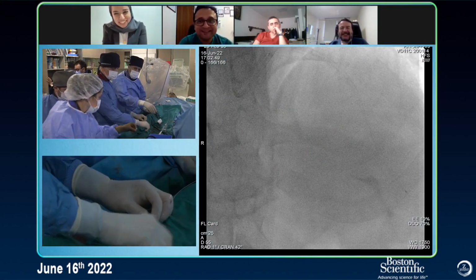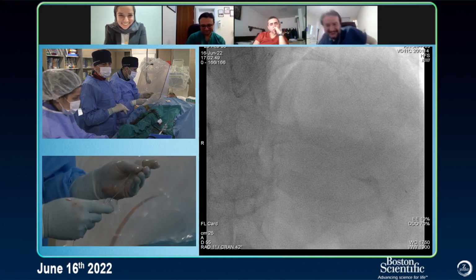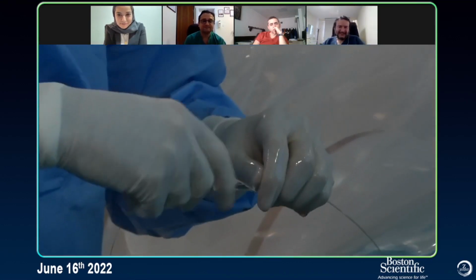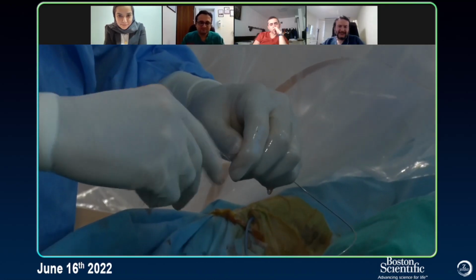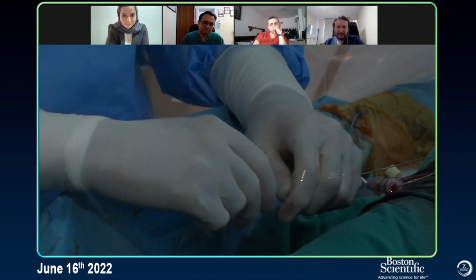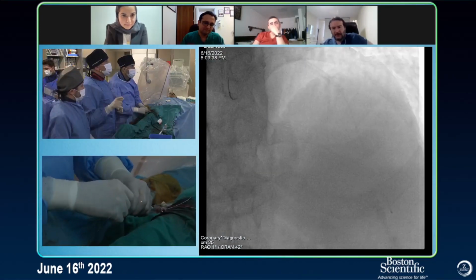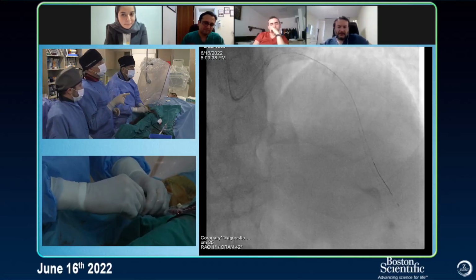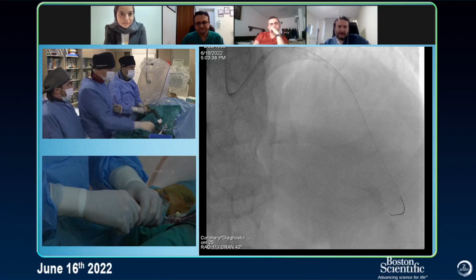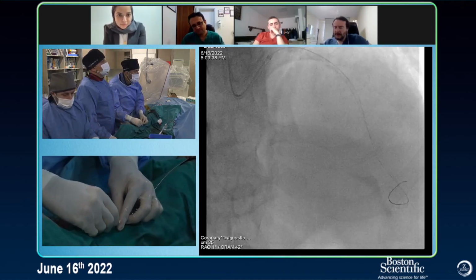I like complications. Solving them is fun. So inside the Mamba, we insert a workhorse wire of choice, and we will do dilatation before we do trio dilatation. But before dilatation, I like to insert a wire to the big diagonal, because after dilatation I might have a dissection and it will not be easy to go to this big diagonal.